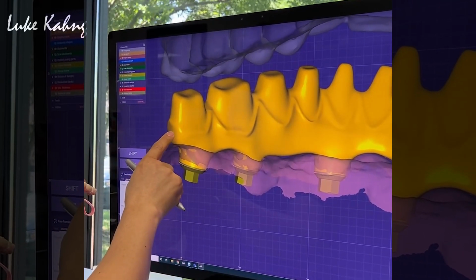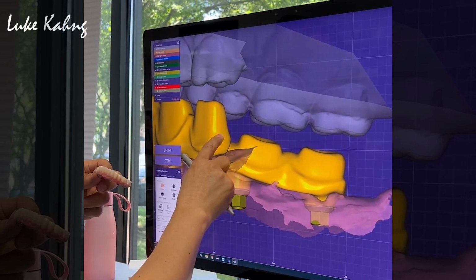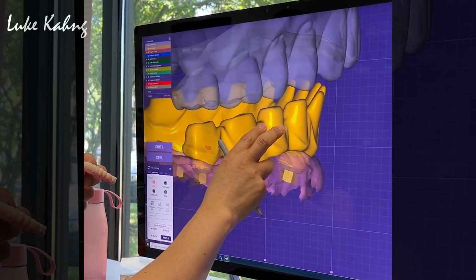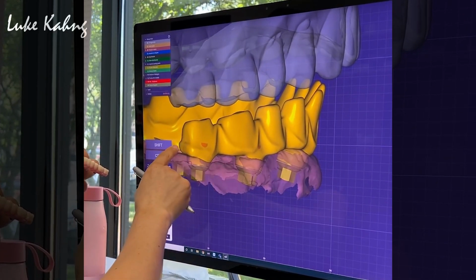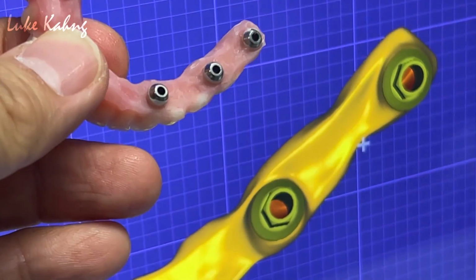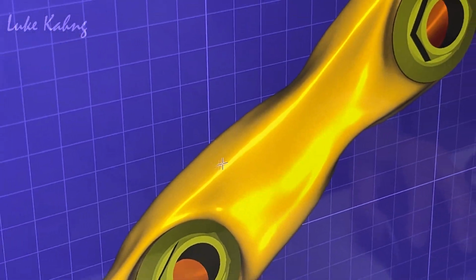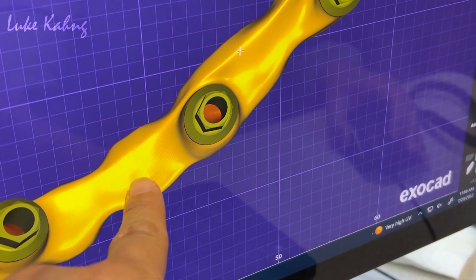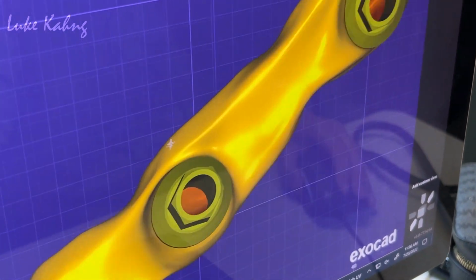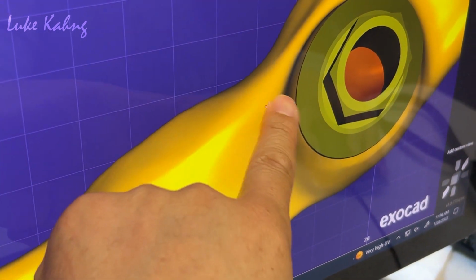Same thing. I don't need this. It's good. So you can bring down here more. All right. Okay. So now we're trying to cut it back here, but we have to worry about the pink. Here, cut it a little bit. Just a little bit more, bring it in. Yep, that's good. Right, here too.